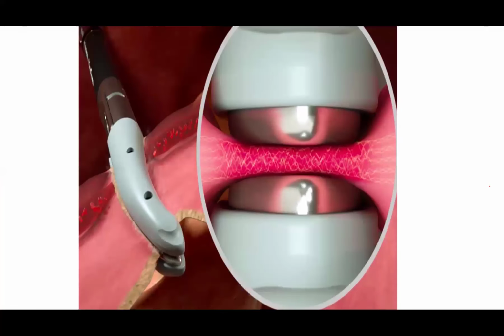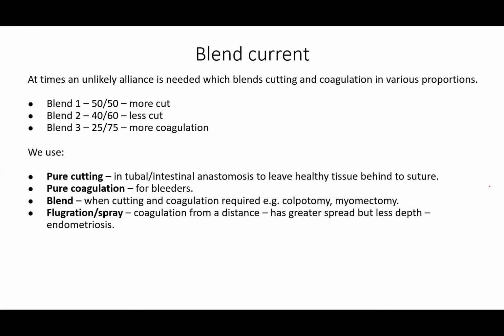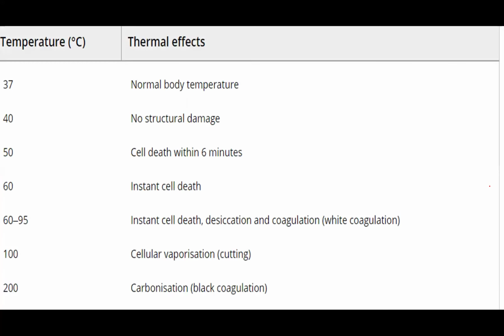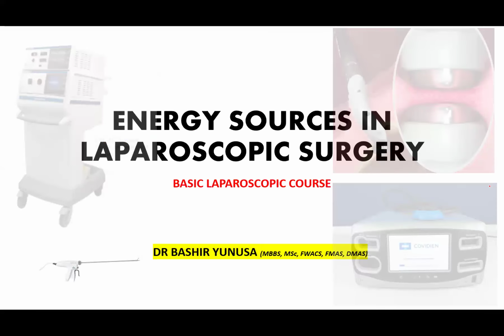The next lecture will be on sterilization of laparoscopic instruments. By the way, as a surgeon, you should know everything about your laparoscopy, both what the technicians should do and what the peri-op team should do about sterilization.